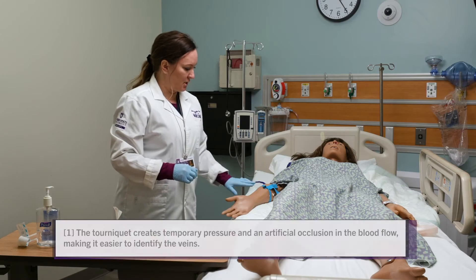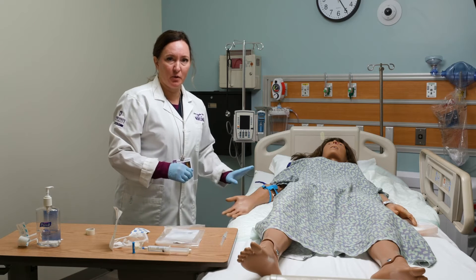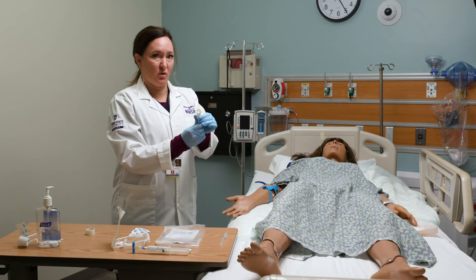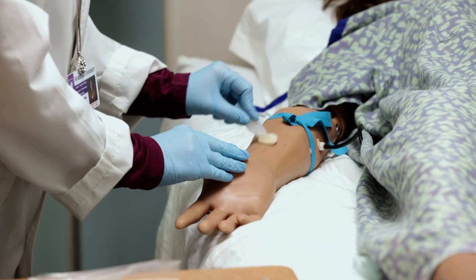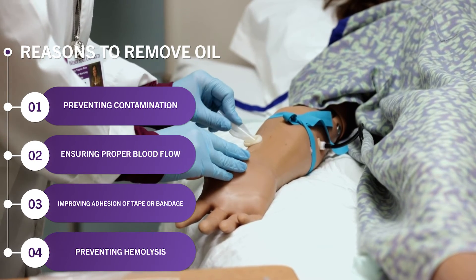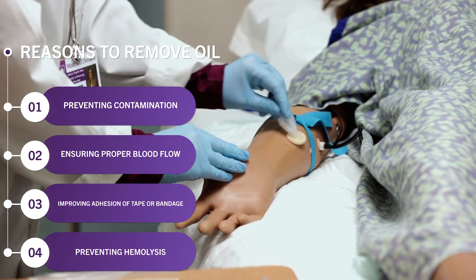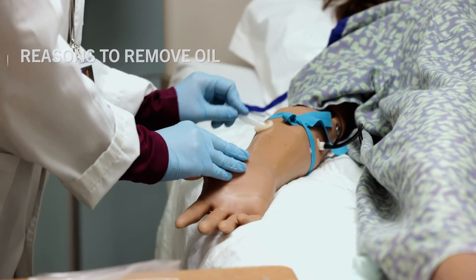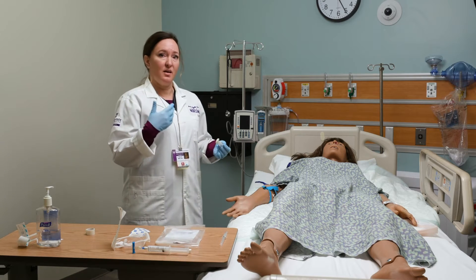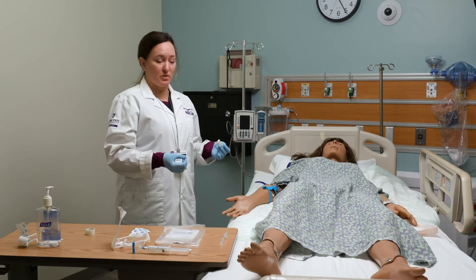After you place the tourniquet, give it a minute for the vein to fill up. A gentle stroking of the vein is acceptable, but you don't want to hit it hard. Get out your chloroprep, squeeze the little wings to crack it, and then cleanse the site right over the vein back and forth. Cover the whole area where your Tegaderm is going to sit because you want to get all of the oils off of the skin — back and forth in both directions for 30 seconds. Then allow it to air dry, as that's when it's seeping down through the layers of the skin and killing bacteria, so that part is really critical.